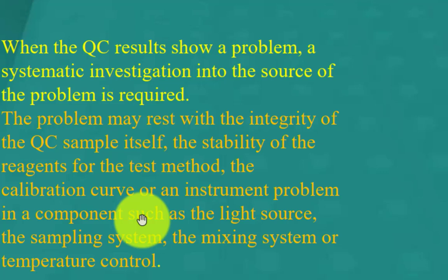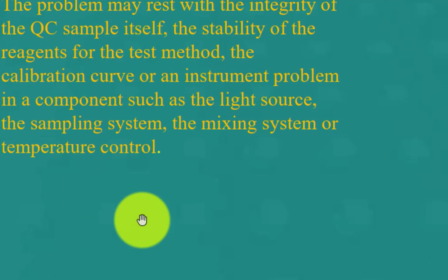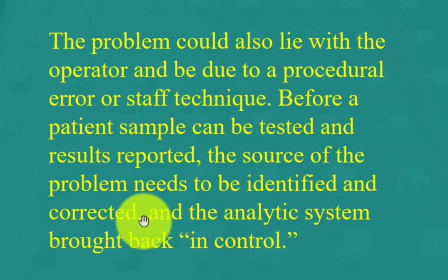The problem may rest with the integrity of the QC sample itself, the stability of the reagent for the test method, the calibration curve, or an equipment problem in a component such as the light source, the sampling system, the mixing system, or temperature control. The problem could also lie with the operator and be due to procedural error or staff technique.